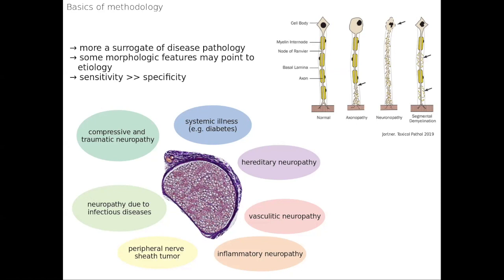So MR neurography is quite a sensitive technique to the underlying disease process, but at the moment not very specific to the different nerve pathologies.